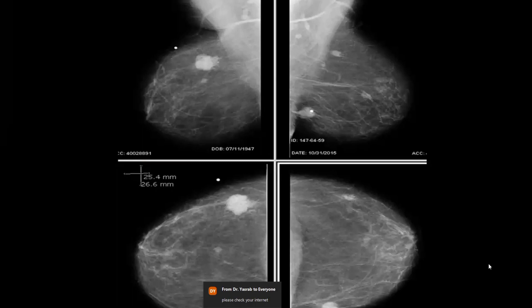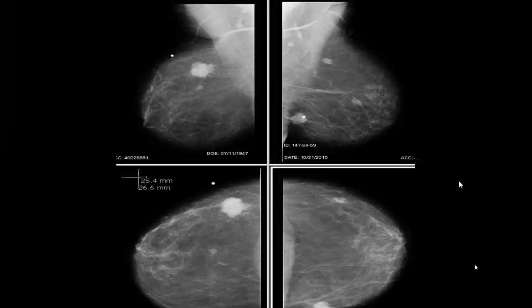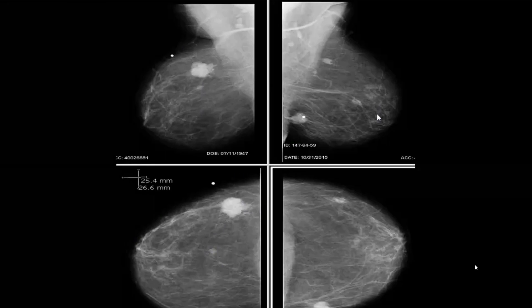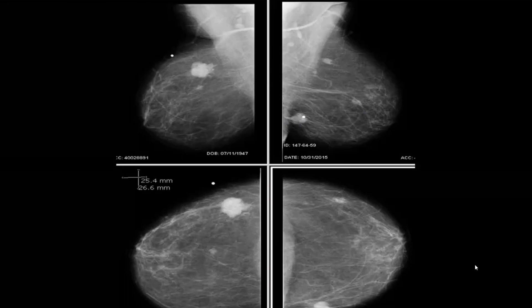Another case — spot the lesions. On the right side, we see an irregular spiculated index lesion with irregular margins and posterior infiltration, plus a satellite lesion in the upper outer quadrant. On the left side, the index lesion is in the retromammary space infiltrating the chest wall, with several additional satellite lesion areas. Looking at these mammograms, you have to label them as BIRADS 4 bilaterally.